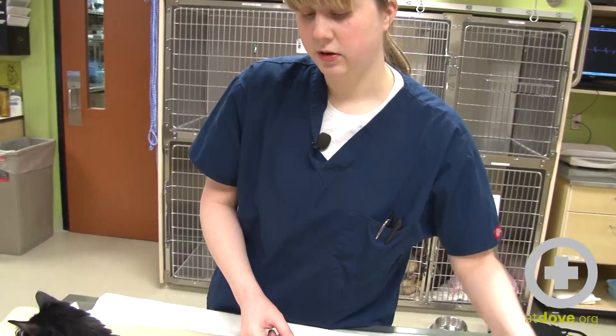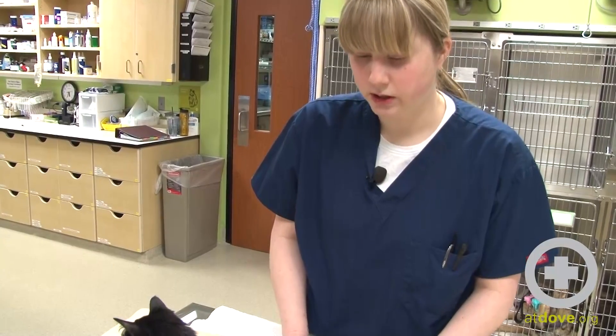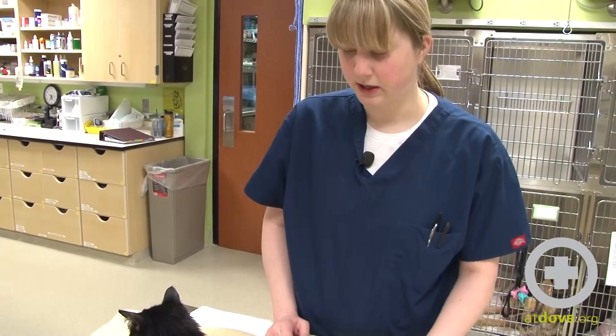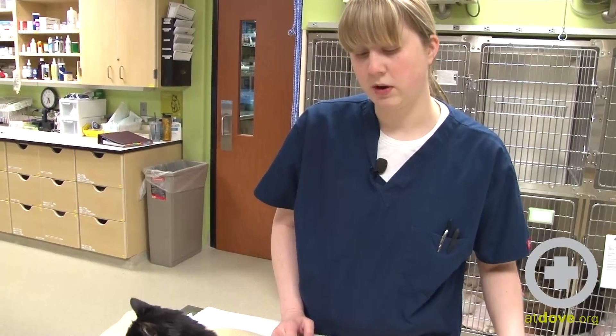We've been giving her feedings of 12 milliliters of AD every four hours. We'll slowly increase the quantities and decrease the frequency as she begins to handle it okay, but this is only her second day and only 12 hours into feeding, so we're still going slow on that.